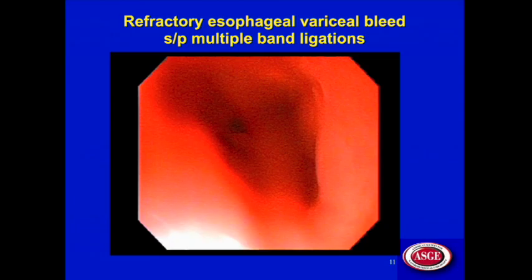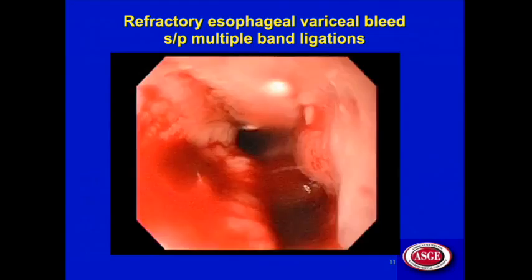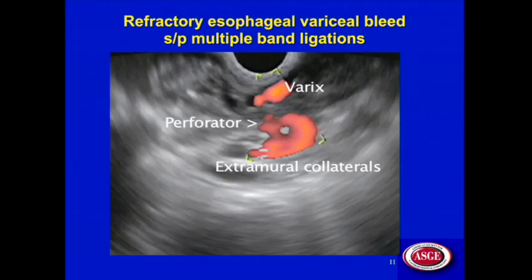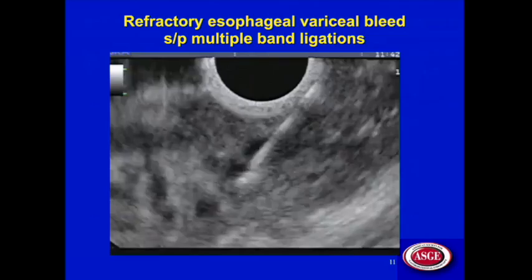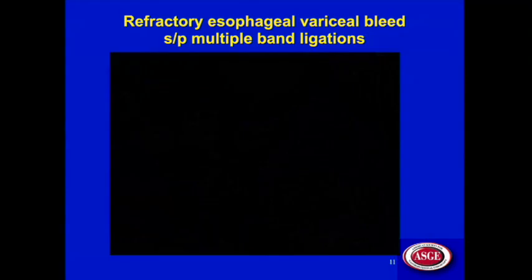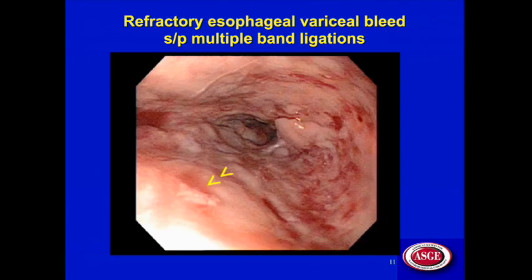Here's another example: a refractory esophageal variceal bleed after multiple band ligations at other institutions. You can see the bleeding from the esophageal varix. Switching on the Doppler, we immediately see the extramural collaterals and the perforating vessel — the feeder for that bleeding varix. Targeting the lumen of the perforator vessel in the same manner as the De La Foix case, the bleeding stopped completely. You can see the glue plug where the glue exited from the puncture site.